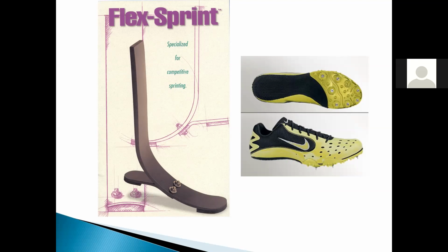The ankle spring has got a lot of bending and energy return. And that's the same reason that if you look at this prosthesis, the heel doesn't touch the ground. The heel doesn't touch the ground with this sprinting foot, because you want to really maximize the bending, because maximizing the bending maximizes also the energy return.